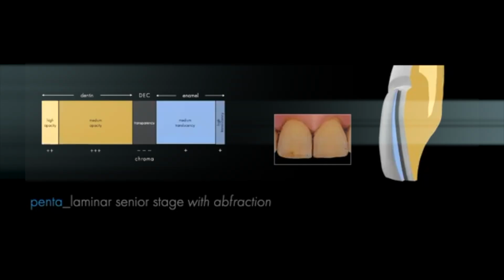But the reality is that this kind of tooth, with long-term cervical exposures, fractures and really not a normal aging pattern, because at the end of the day, this is a pathologic aging pattern, has been used as a model of layering, right? So all the layering techniques have their origin in ceramists observing extracted teeth. Those ceramists were really trying to find out how the tooth is really built from the inside. So they cut teeth, they used these extracted teeth in order to learn more from nature.